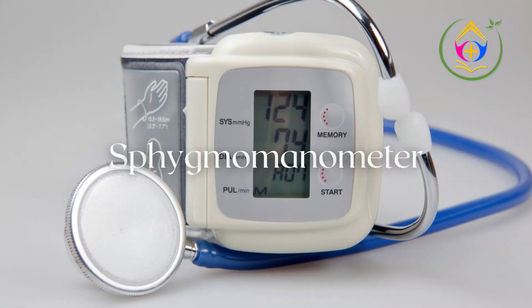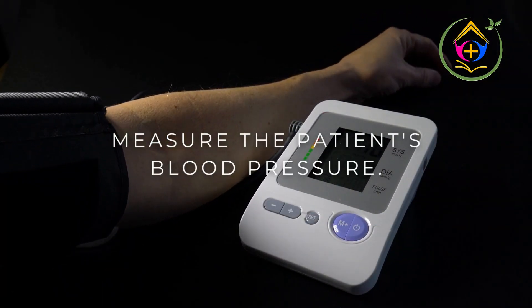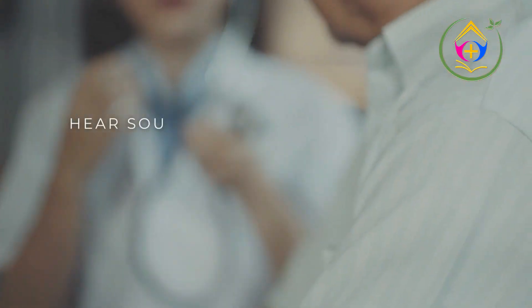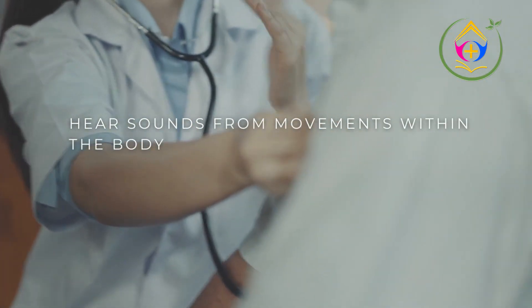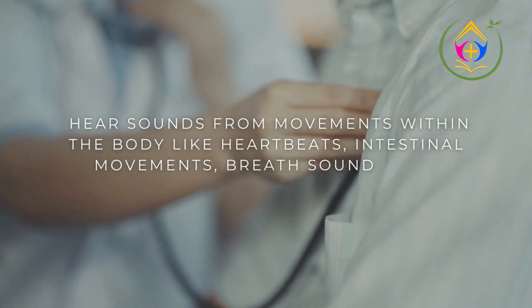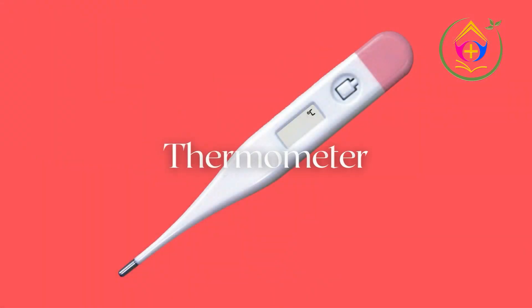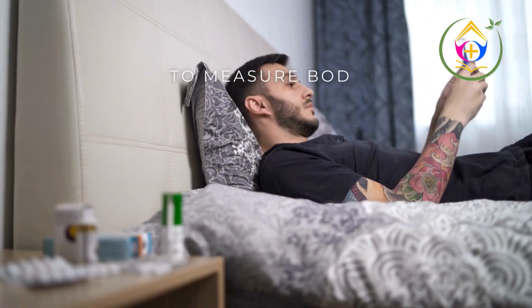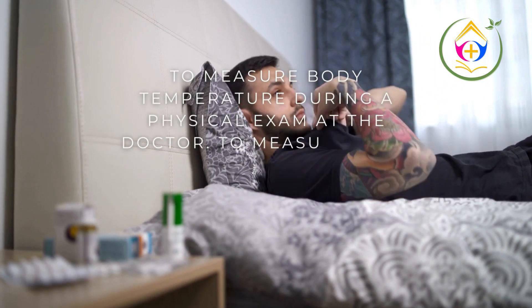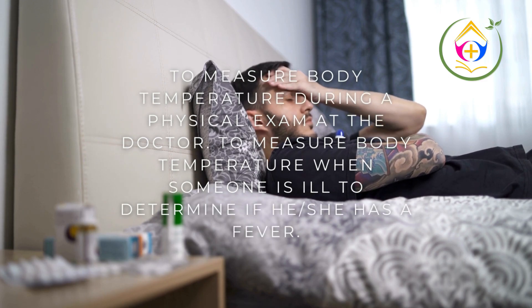Sphygmomanometer: measures the patient's blood pressure. Stethoscope: used to hear sounds from movements within the body, like heartbeats, intestinal movements, breath sounds, etc. Thermometer: used to measure body temperature during a physical exam, or when someone is ill to determine if he or she has a fever.